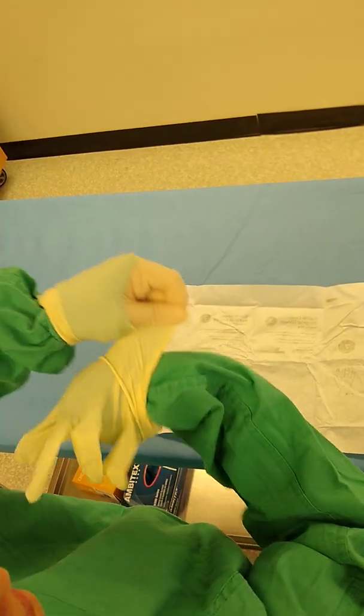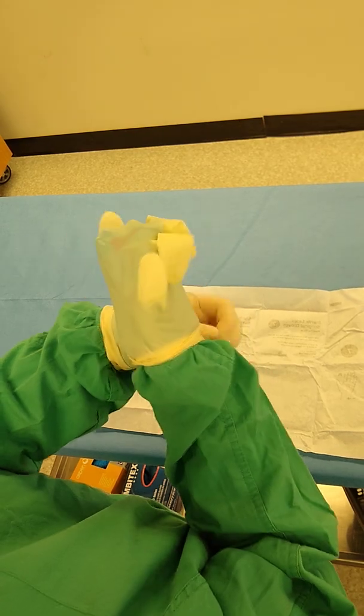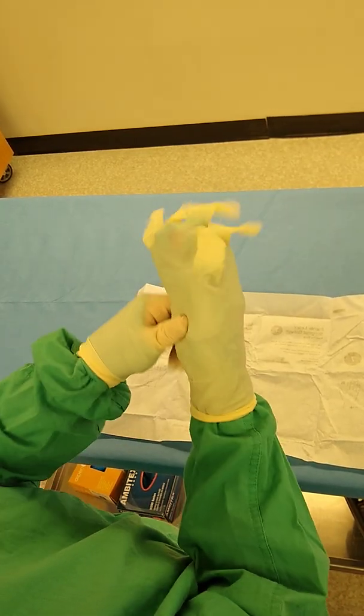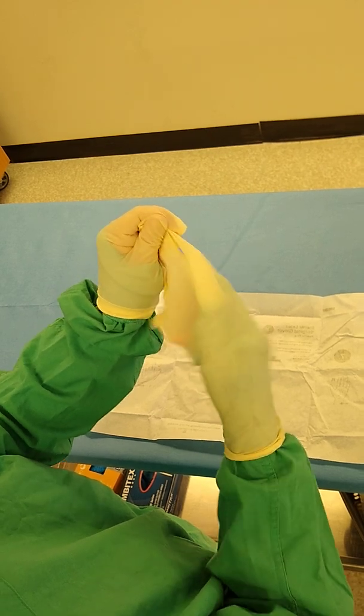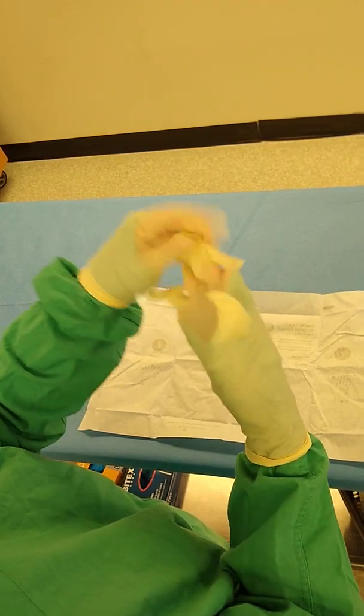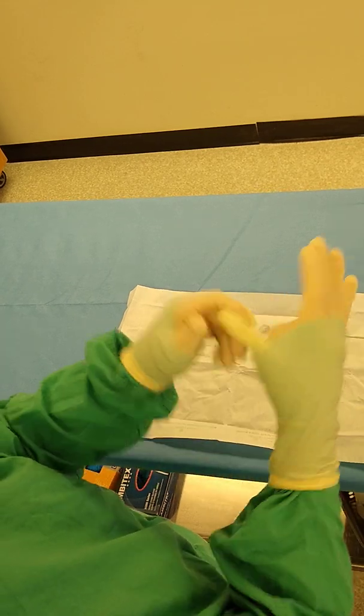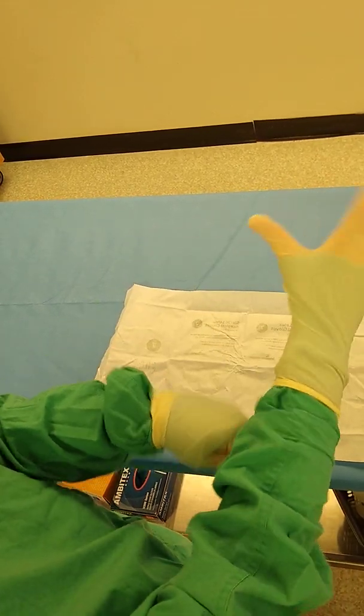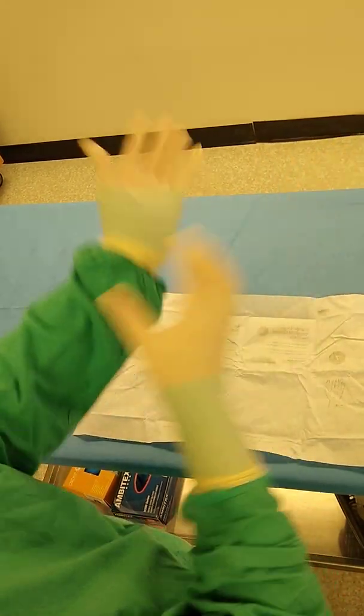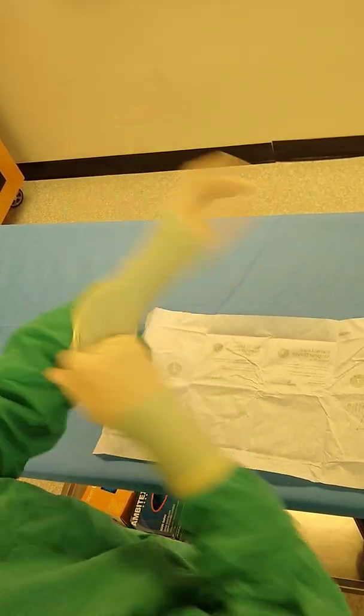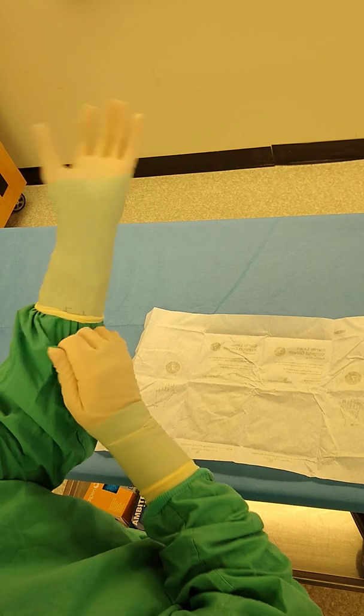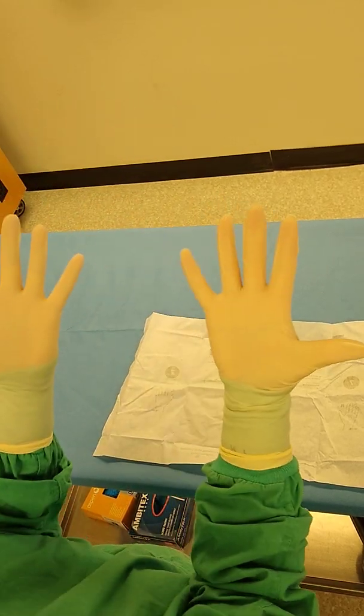And I'm going to pick up over and bring my hand in there. Okay, now you just fuss with it until you get your fingers into place. Okay, you can adjust - you want to keep your cuff inside your glove.